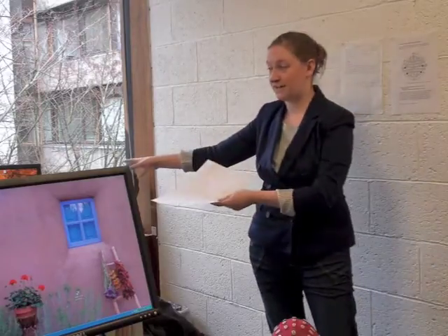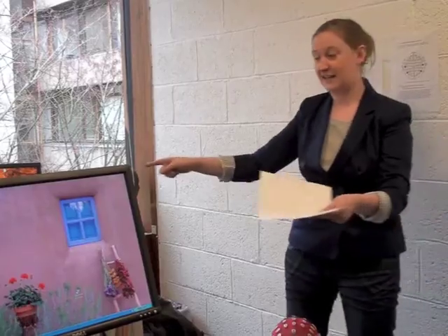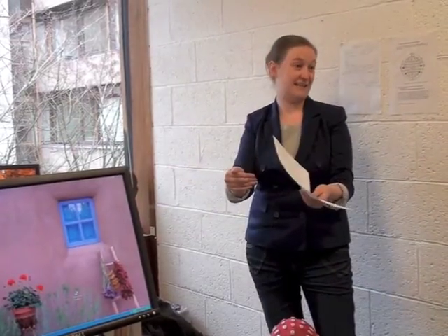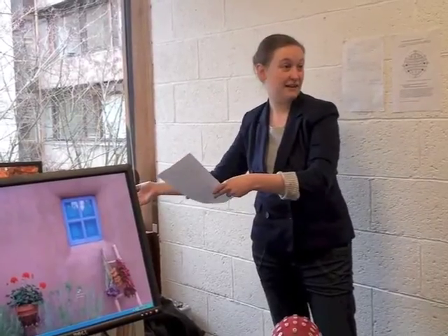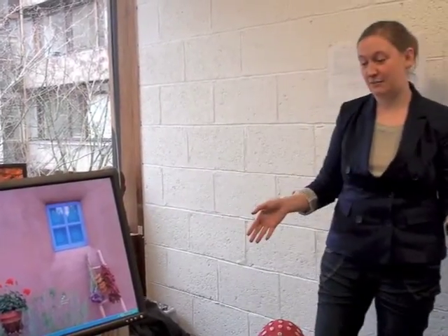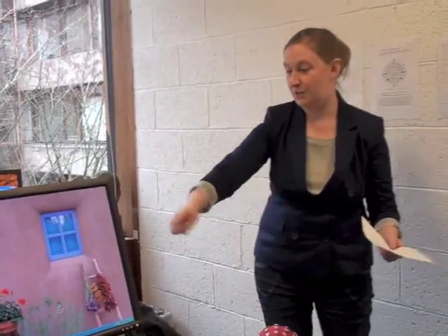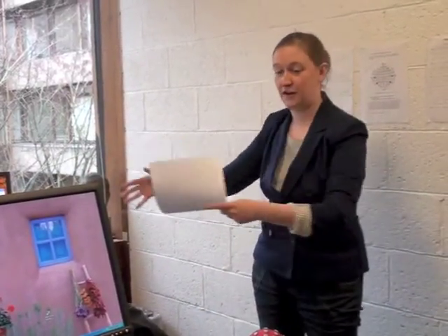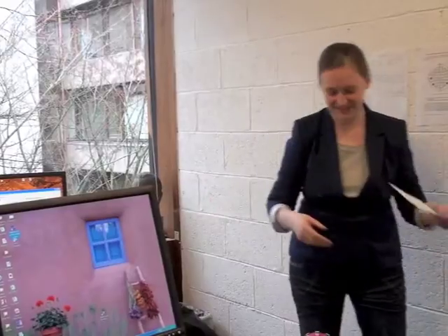The one that's running a presentation that you're showing your participant, and the one that's recording. And this link needs to be instantaneous, because you need to be recording exactly what's happening, exactly as they see something. Okay, so that's the main thing to remember: anything we use here is going to be about communication between the two computers, presentation computer and the recording computer, and communication between those computers and the participant's head, because the EEG is swimming around.